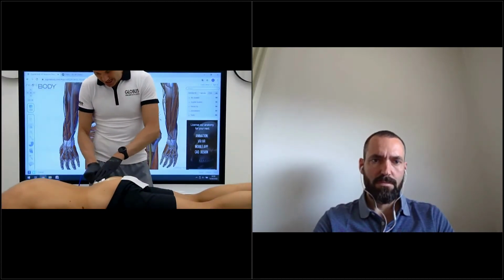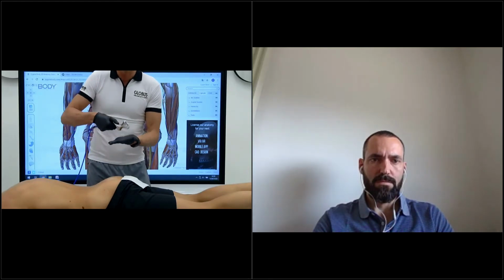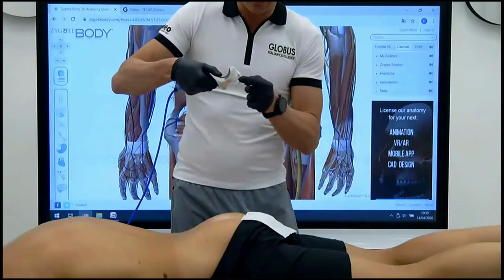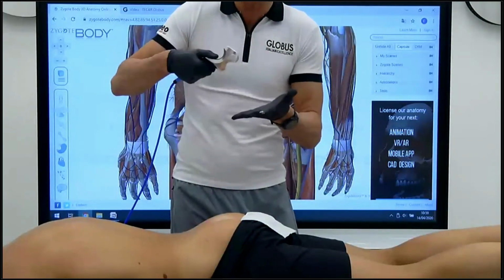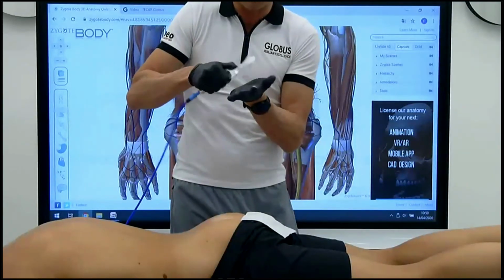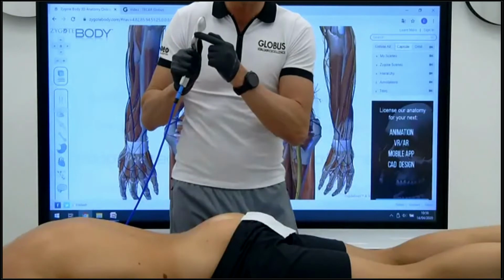In this way, I suggest you use a very flat position at the early stages when we start to use it. Otherwise, it's so aggressive. When we use it in an orthogonal position, the surface contact is very small, so the energy is very high. So we need to stay in a very flat position at the beginning, using this 30 degrees edge here, as you can see.